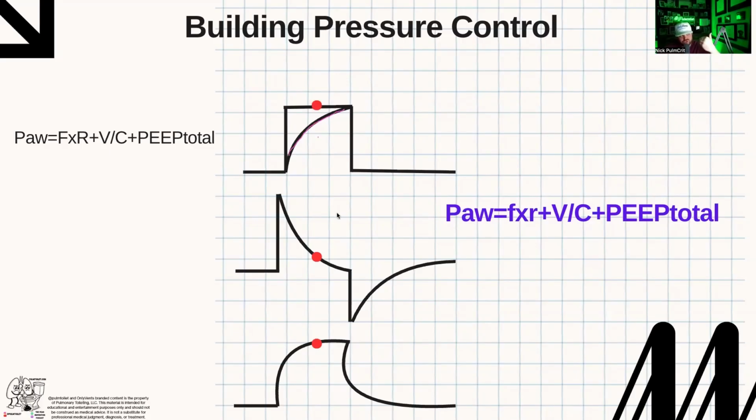As your alveolar pressure rises, your flow is going to go down because your delta pressure goes down if the patient's passive. So as you fill the lung up with volume, that exerts a pressure. Your delta pressure gets smaller and smaller. And then at some point, we're going to assume, just for these cases, just to wrap our minds around it, that at the end of inspiration, your airway pressure equals your alveolar pressure. So there should be no more flow. That's a tremendously key concept.